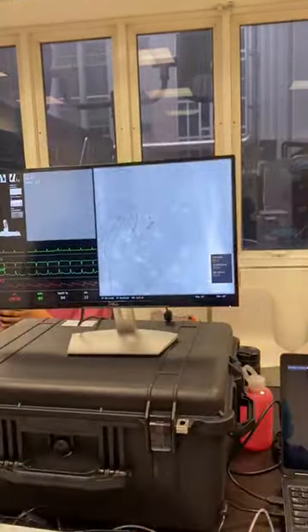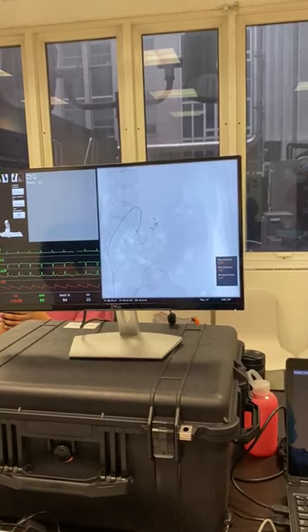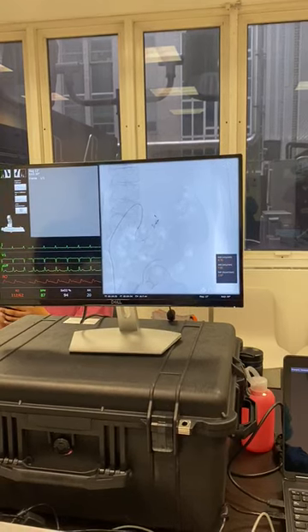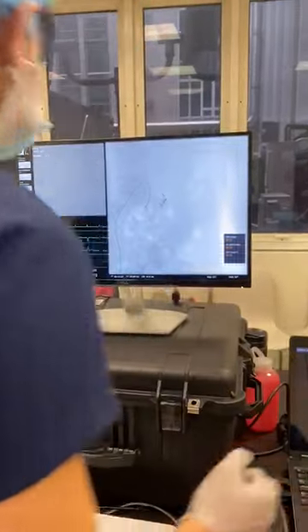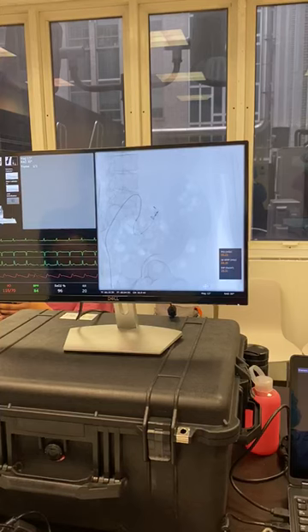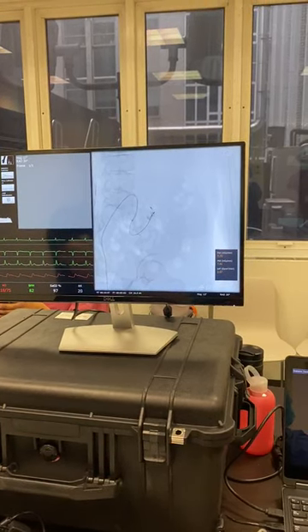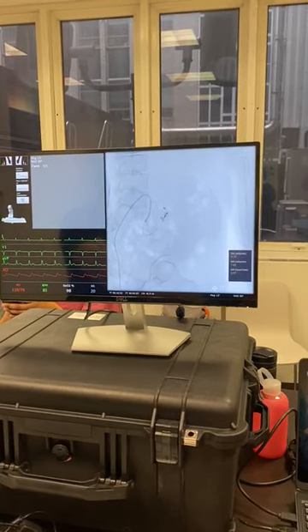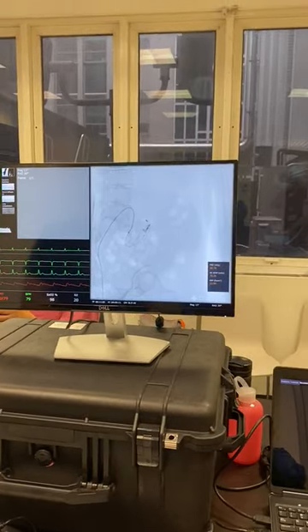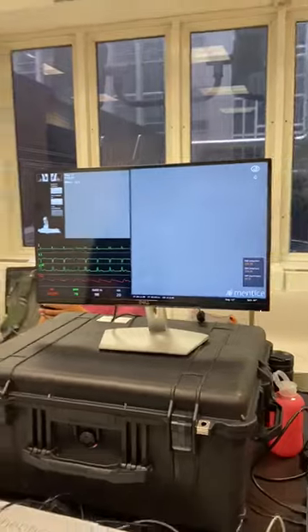We'll do one more coil and then a final run. Coiling across the area of injury allows you to prevent back-filling through a collateral vessel. He'll do a little puff now and we'll see what it looks like — if we still need to put a couple more coils, we can, but hopefully this takes care of the injury. We'll do a DSA. And we see that that vessel has been occluded and that should take care of the bleeding.